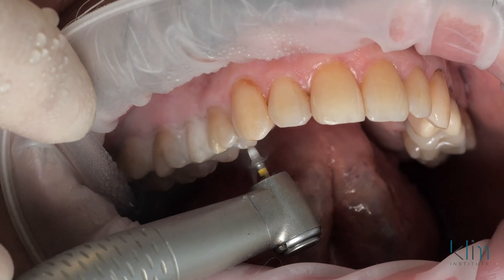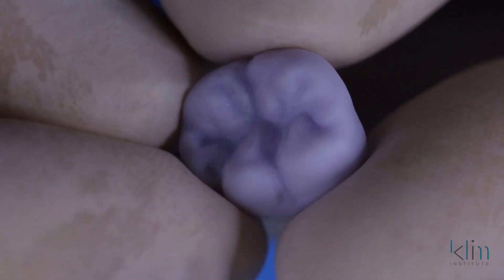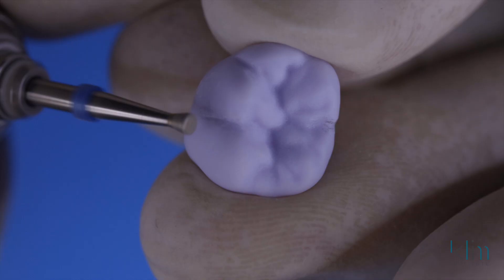The case we're finishing for this video actually has quite a bit of occlusal reduction, so you can see that beautiful morphology. You can't get that all the time if you don't have enough reduction, and maybe it won't fit the mouth because if your cusps are too steep, you're going to get collision in your occlusion. That's for another video and discussion that you'll find on this site.